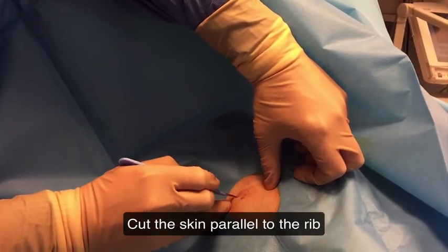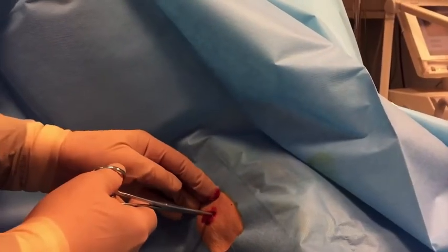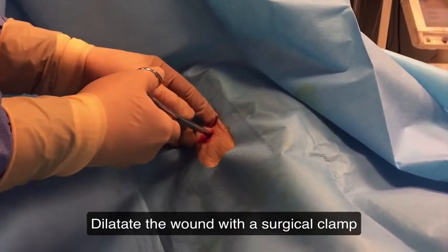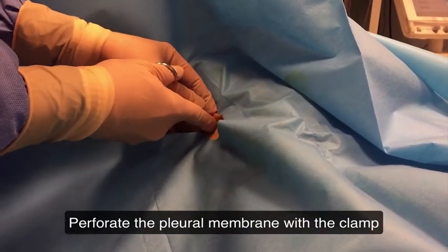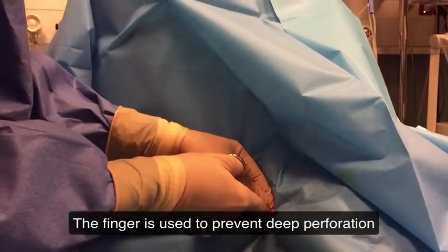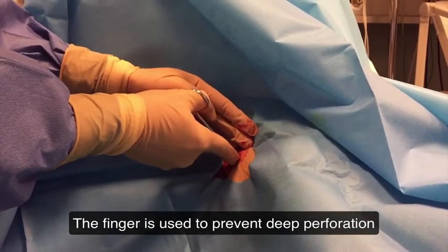Make your skin incision 2 to 4 centimeters long and parallel to the rib. Now use your surgical clamp to dissect the subcutaneous tissue. Perforate the pleural membrane using your surgical clamp. You can use your index finger to prevent deep perforation that might damage the liver or other tissues.